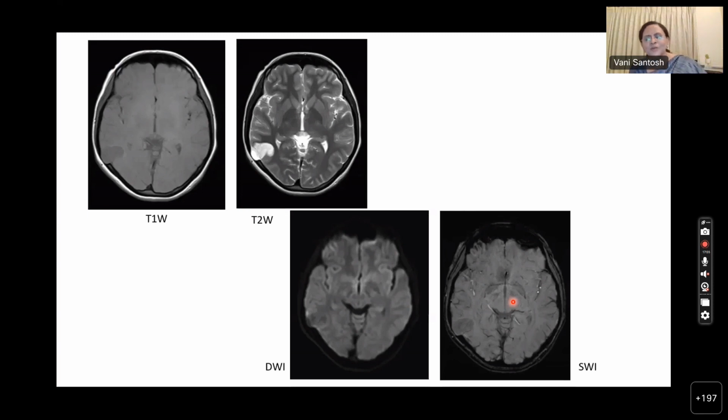Kajri, if you can just quickly describe this, I'll approve your annotation. Yeah. So what we are seeing is these 4 sets of images. Again, we look at the T2. What we are seeing is basically this lesion. If we compare it with the other lesions, this is a very well circumscribed lesion. It is located in the cortex, basically in the temporal lobe. So it's a temporal lobe cortex lesion, and there is no perilesional edema. It's a very homogeneous lesion, very bright on T2-weighted image.